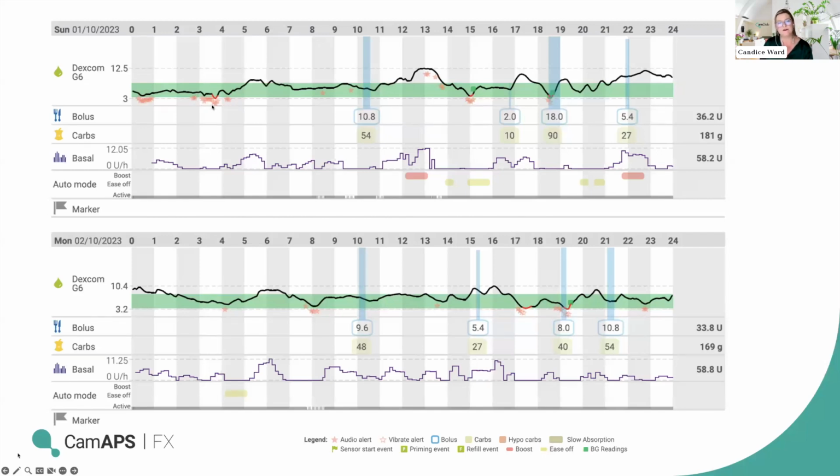And when we discussed with her, we noticed that she'd set her alarm at 5 for hypoglycemia, which is exactly the target the algorithm was aiming for. So unfortunately, the alarm was driving her to wake up at night and hypo-treat and eat through the night, which is causing some of the disturbances. I find it nice to see how much alarm burden you can get from the PDF report, so you can see what's happening. So at night, she's feeding and putting Ease-off on when it may not be necessary.